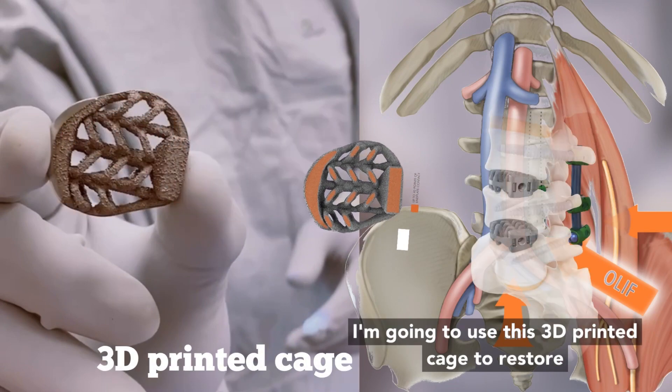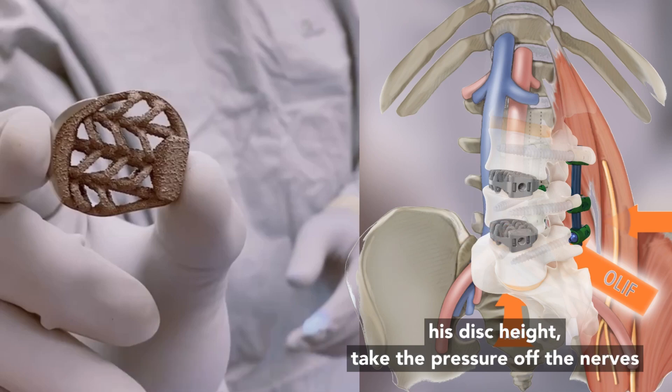I'm going to use this 3D printed cage to restore his disc height, take the pressure off the nerves, and restore function.